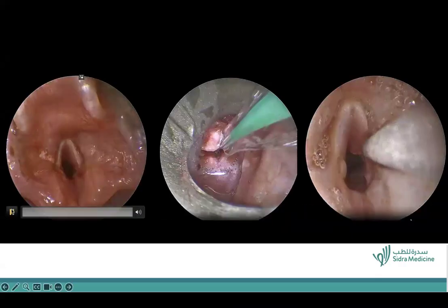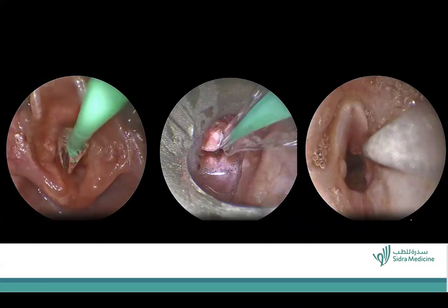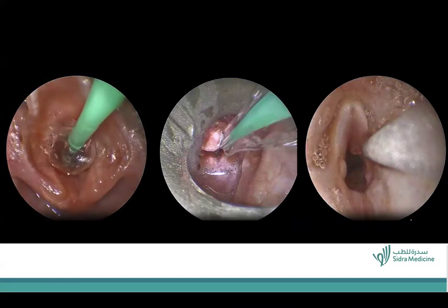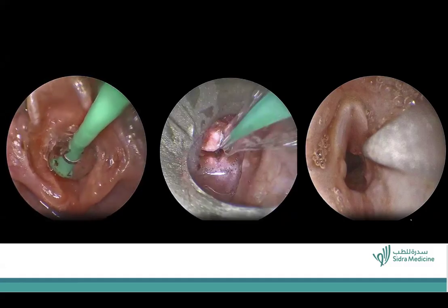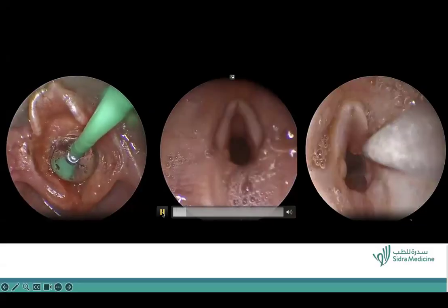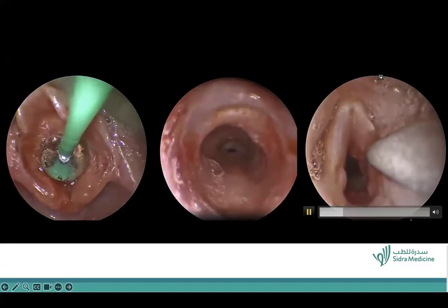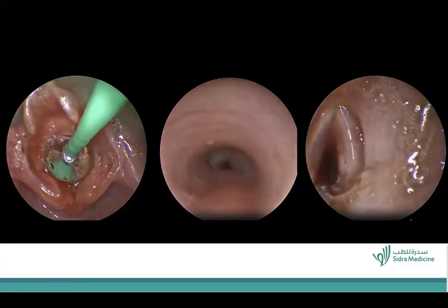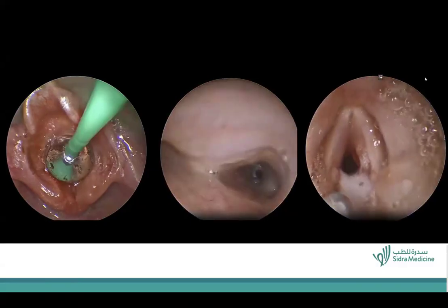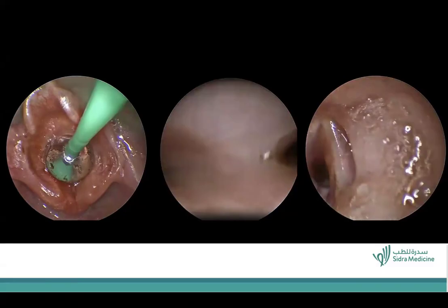I hope this video is going to play. So we took the patient in, and that's a balloon going in. There are different sizes of balloon depending on the size of the child's airway and the age of the child. We inflate it at certain pressures, then visualize what that looks like, go to the areas affected by the stenosis, inject steroids into those areas, and then once more dilate so that you're pushing the steroid to where it needs to go. And then you're getting a more patent airway.